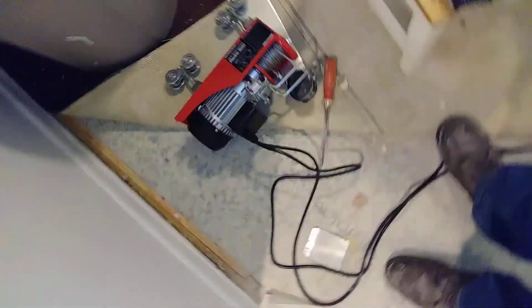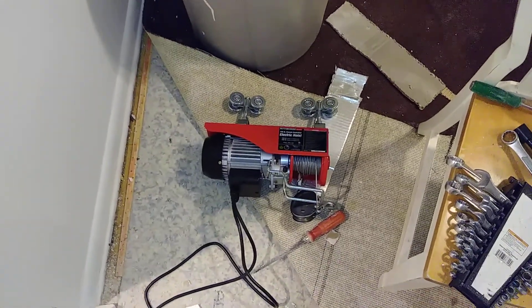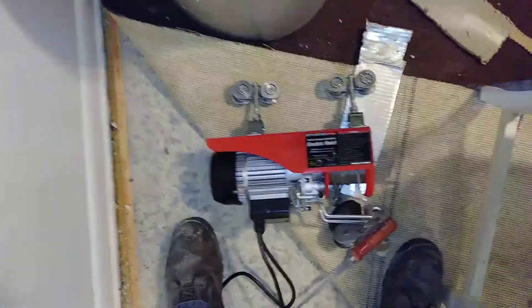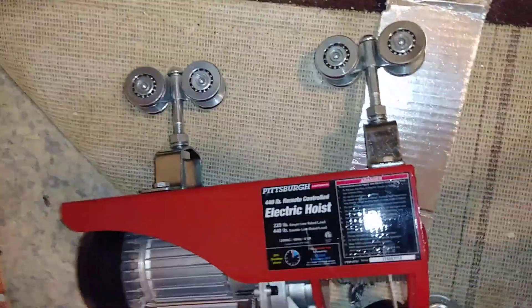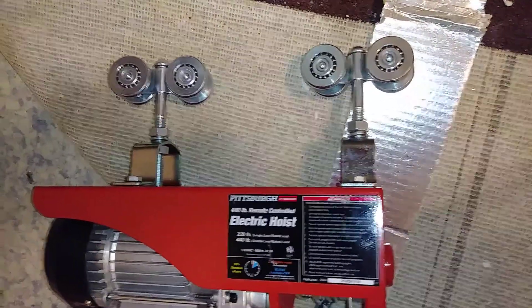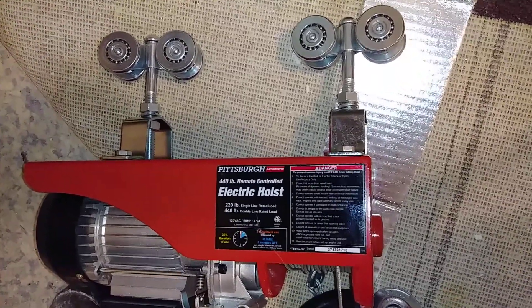Pardon the mess, but as with anything that's under construction, we're gonna have a mess here. Let me show you how these rollers go on the track. This is for the trolley lift system for the elderly — I've got a mother-in-law that we're going to be using this system for.